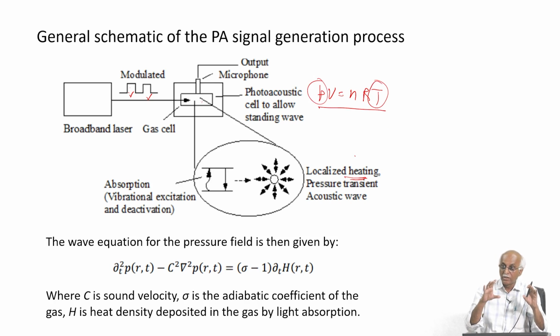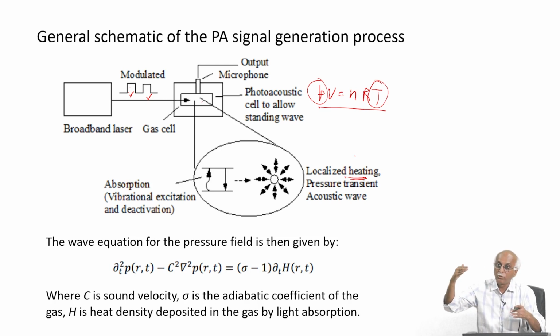For a constant cell with a constant volume, the density of this gas species changes, and a density or pressure wave is formed, because of the temperature increase and decrease: high pressure, then low pressure. Because of this pressure wave formation, an acoustic signal is generated. So, on, off, pressure high, pressure low, it will generate acoustic waves.